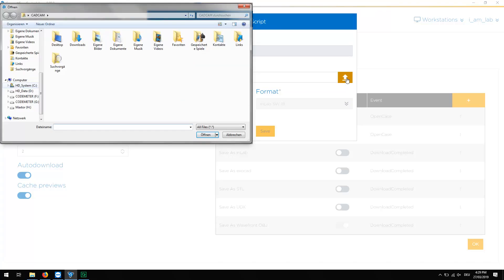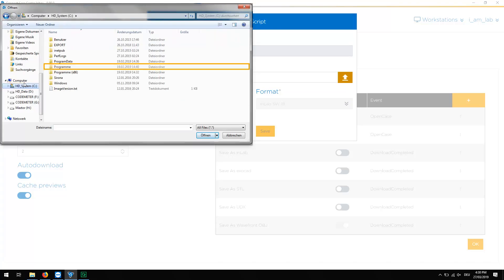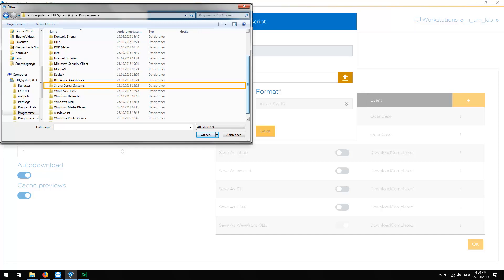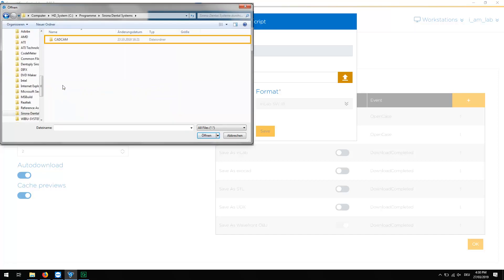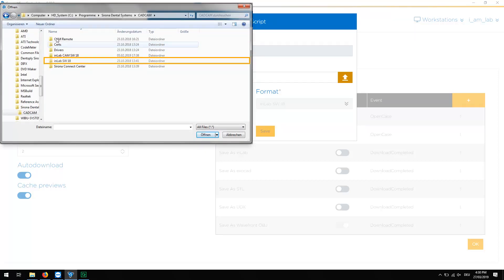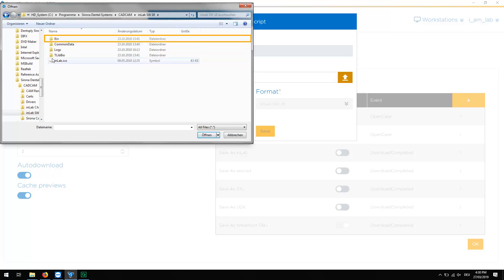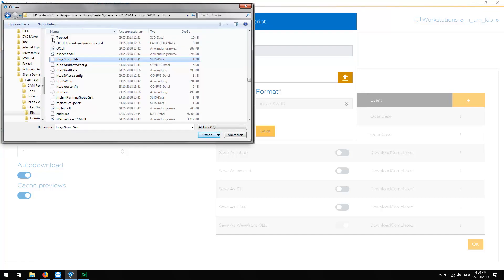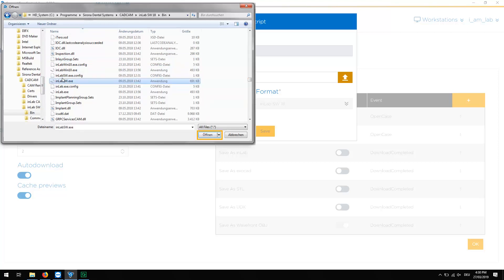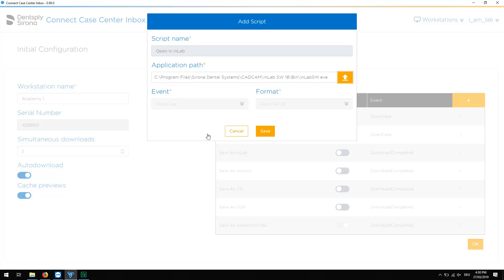Generally, this is located on the C drive, under Programs, Serona Dental Systems, CAD-CAM, InLab Software, inside the folder Bin. We select the corresponding .exe file and confirm with Open. To enable this script, we click Save.